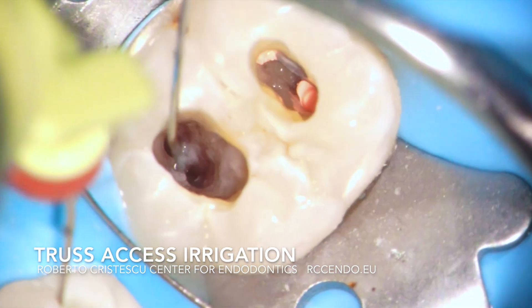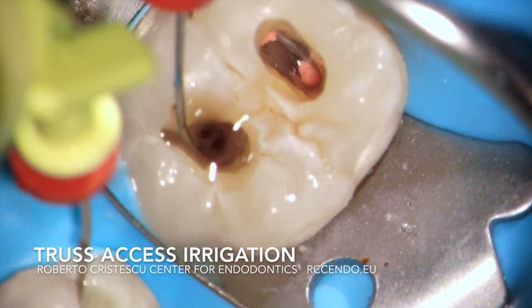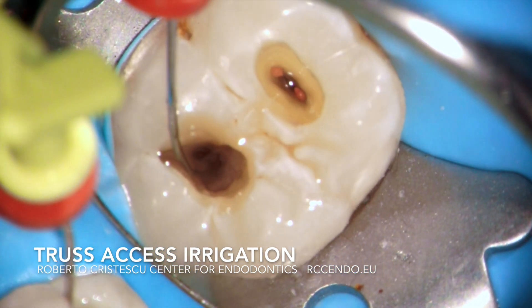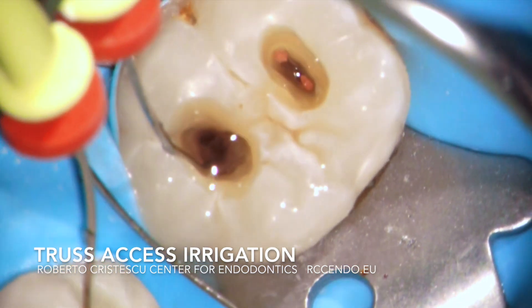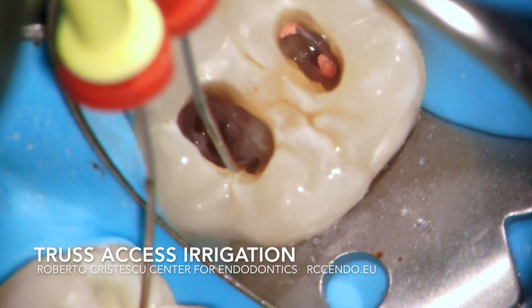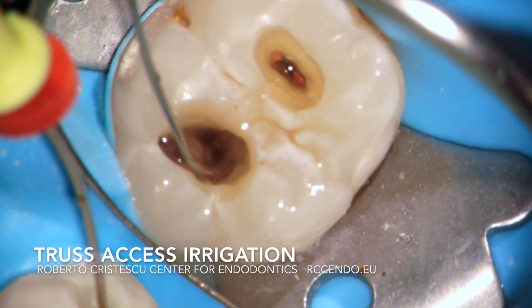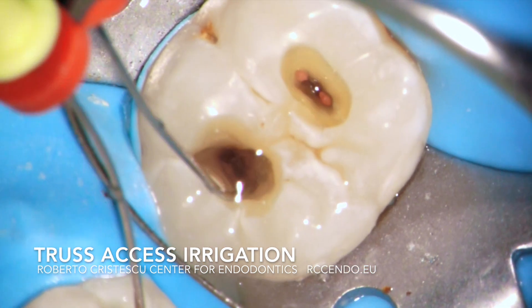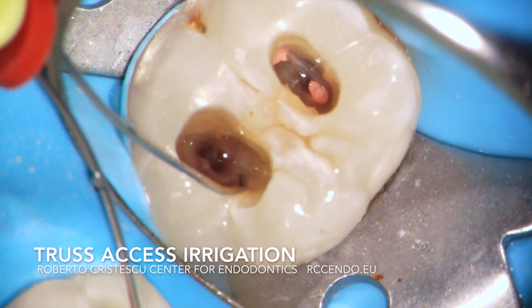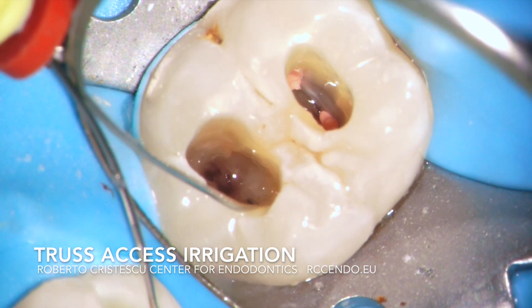Very often people have questioned whether irrigants can pass into the pulp chamber in cases where the access cavity is made without removing the roof of the pulp chamber. This is a video I made at the end of the treatment, trying to demonstrate how the irrigant passes from the distal aspect of the access cavity into the mesial one, even if we did not remove the whole dentin and enamel structure above the roof of the pulp chamber.